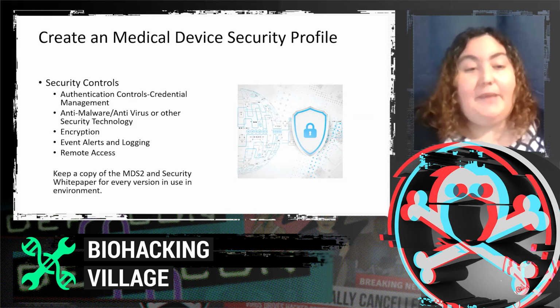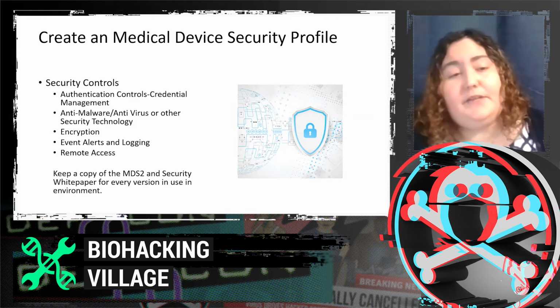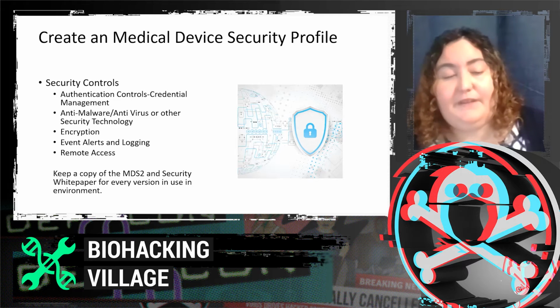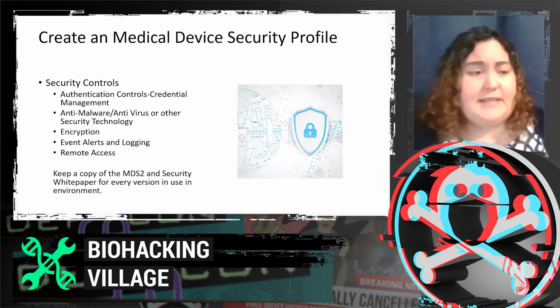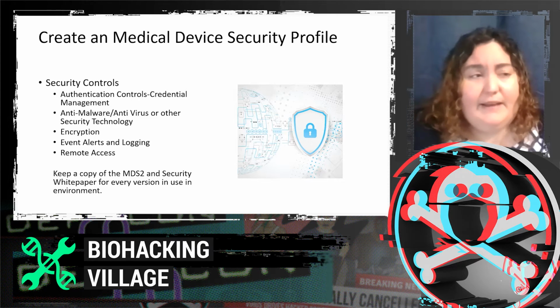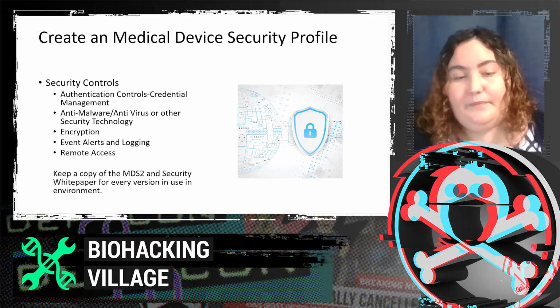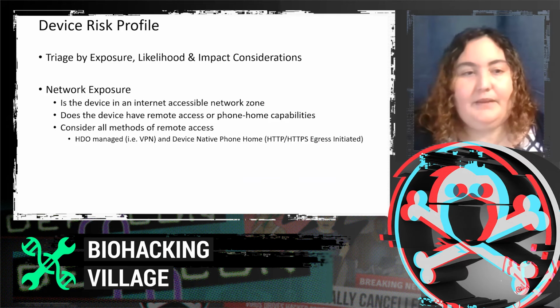You're going to want to keep a copy of the MDS2 security and security white paper for every version of the device that you have in use in your environment. There is enough variety at significant releases that you will need this data. Make it part of your profile.